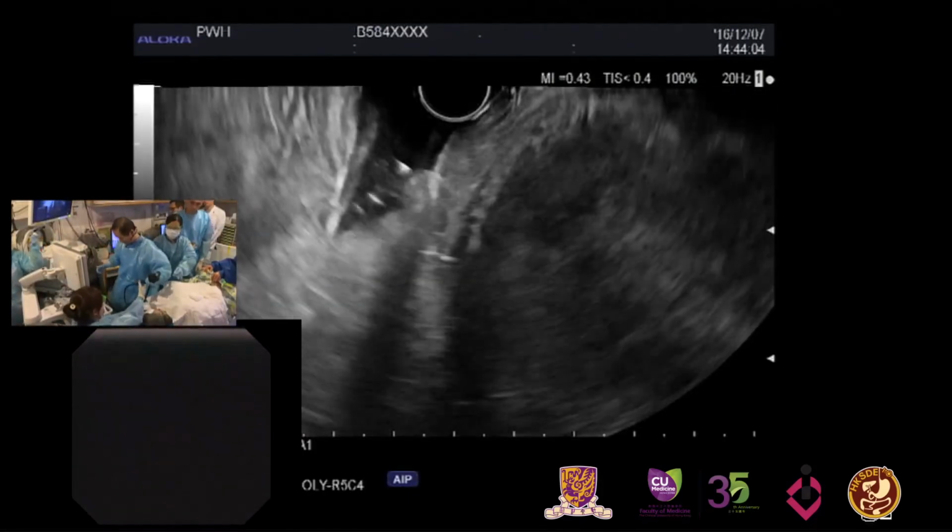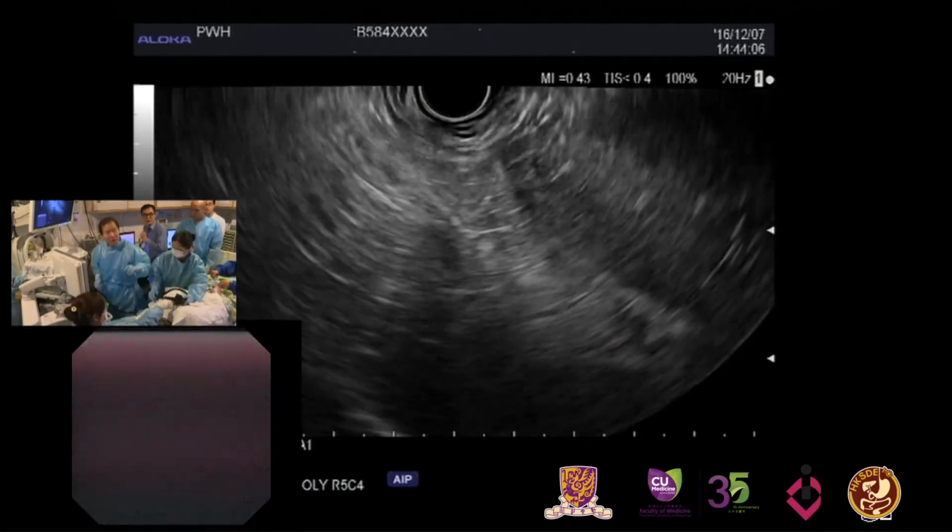Right. Thank you very much. It's a very good demonstration of fine needle biopsy.